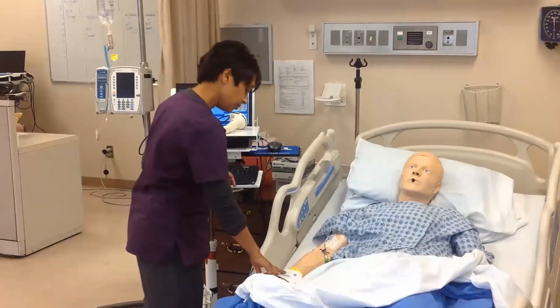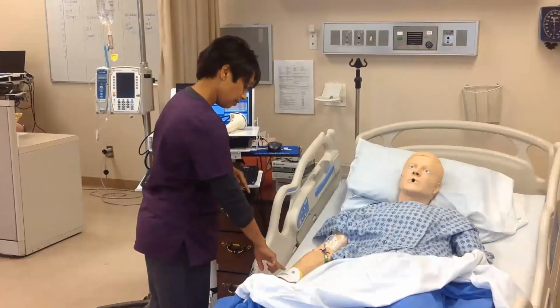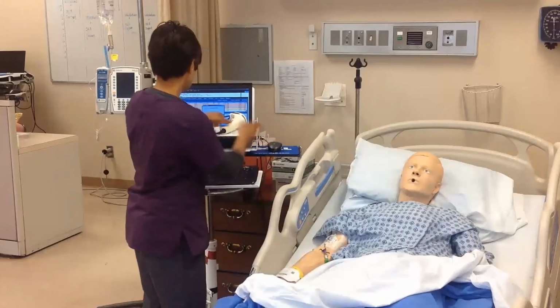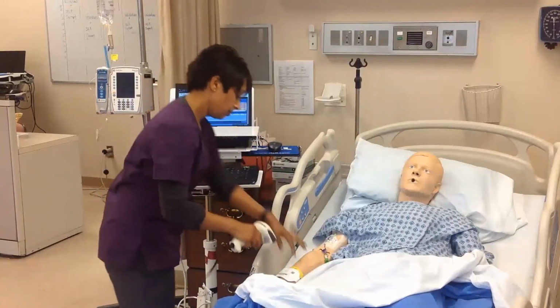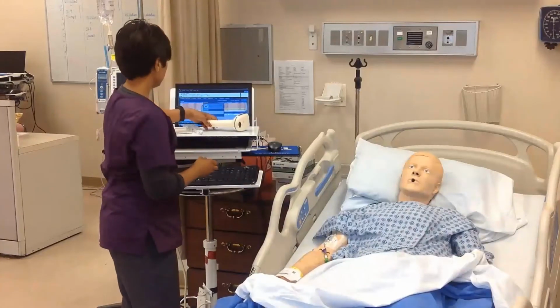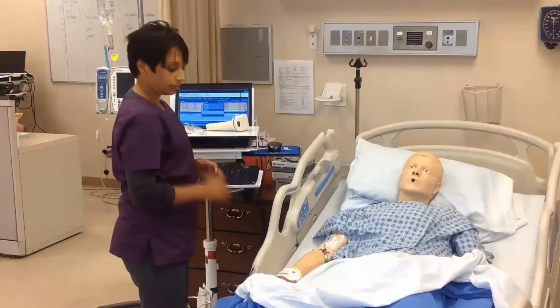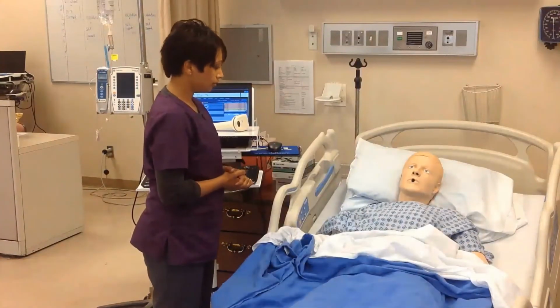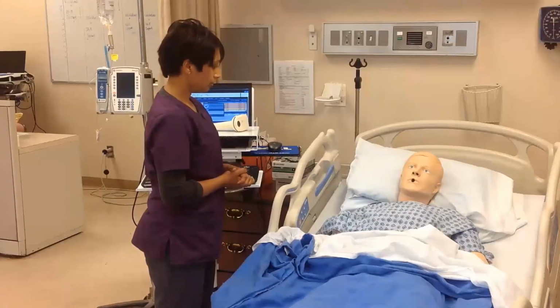Ask patient to verbalize allergies and look on patient's wrists for a yellow allergy bracelet. Scan the patient's bracelet. The screen will confirm with a green check mark that the scan matches the patient. I have your normal saline to hydrate you. Now that the patient knows what he's receiving, complete your assessments.